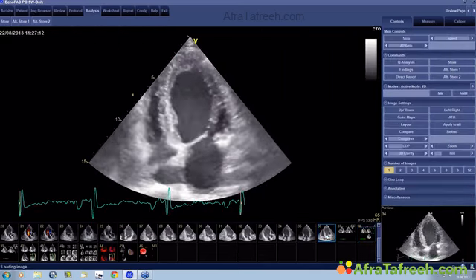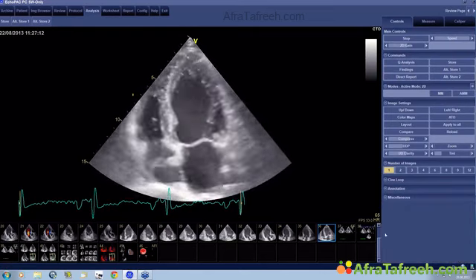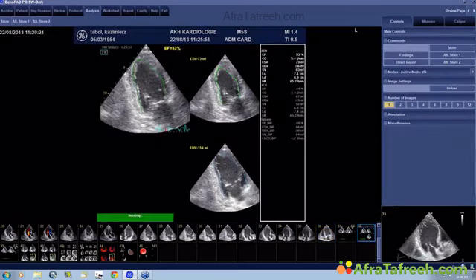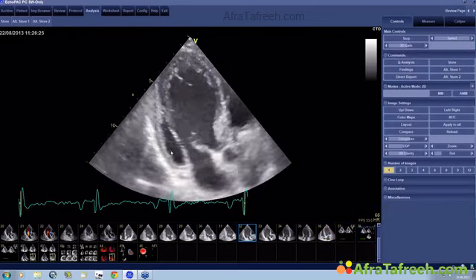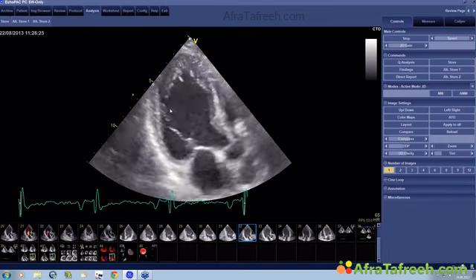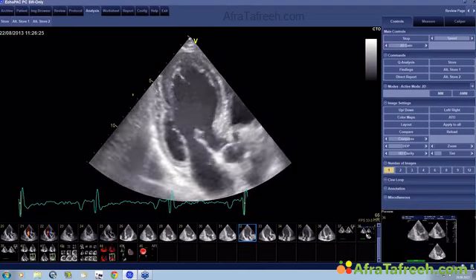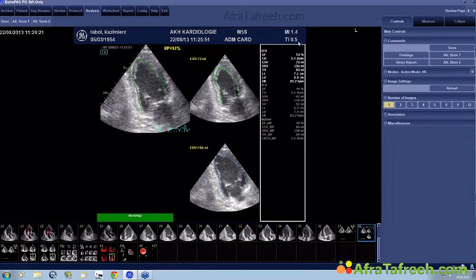But be cautious when you look at ejection fraction, because especially in the setting of infarcts, this can be very tricky. First of all, very frequently, you will not have the posterolateral wall if you do the Simpson, which means that this region where the infarct is largest is not being considered when you calculate the ejection fraction. And here we have a value of 53, which grossly overestimates ejection fraction. We only used a 2-chamber view and a 4-chamber view here. So ejection fraction does not work in this setting.